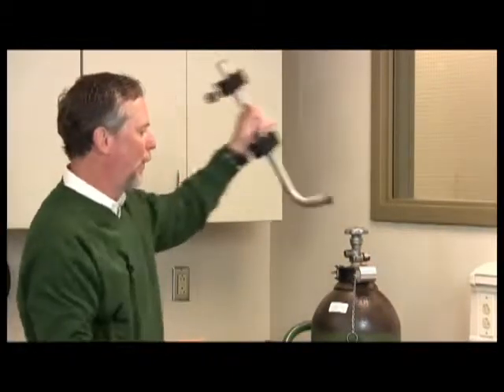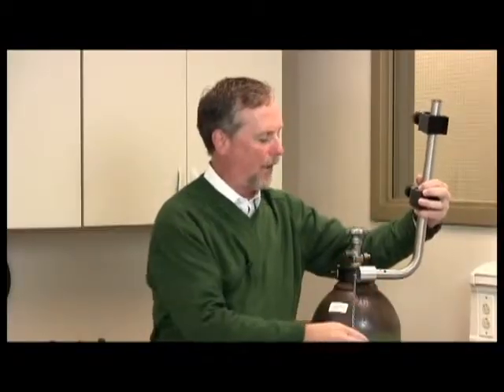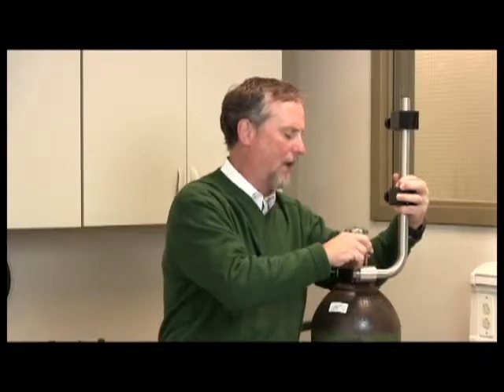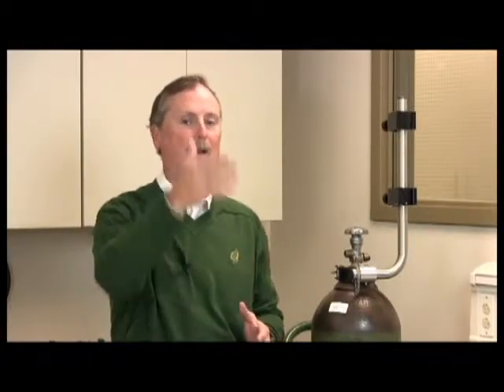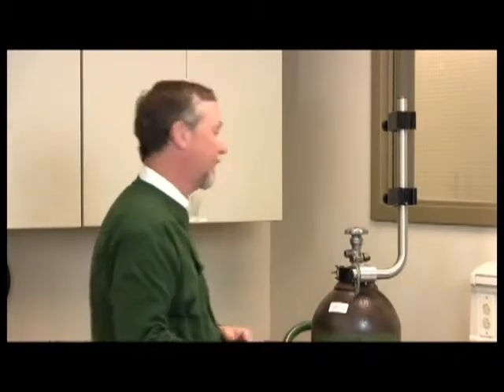So we'll put this pole in, and there's actually three holes in this pole, and that's to fit the different angles that the tank may sit at. So in this case, we'll use the straight up hole since the tank is sitting straight up and down. The one thing that you probably want to do is make sure that, depending if you're using this tank standing up or back on its holders, the blender is straight up and down and that the flow meter sits straight up and down. So that's why there's those 3 holes in there, to change the angle of the pole to match what angle of the tank and cylinder you're using it at.